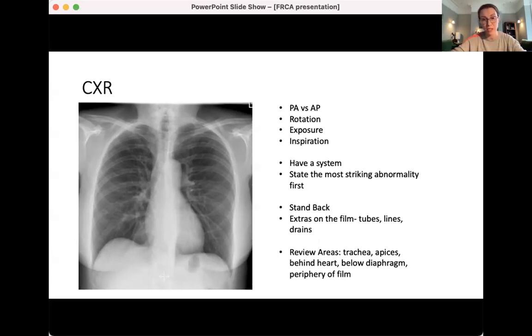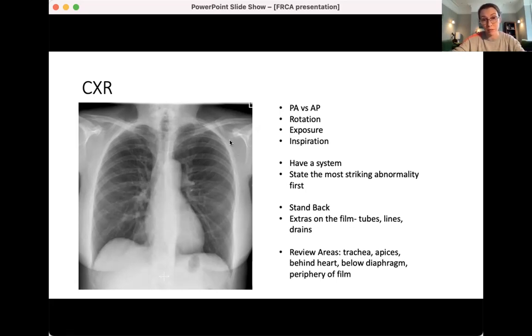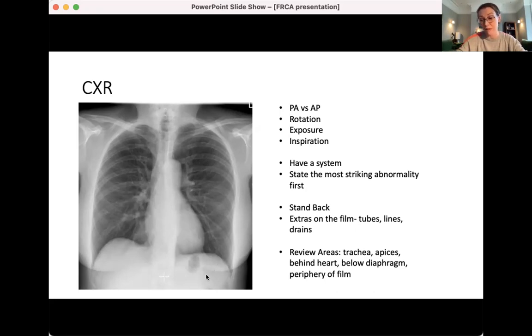Think about the extras on the film: tubes, lines, drains — anything that just jumps out at you. I look at the heart first, then the lungs around it, then the periphery. For review areas, I specifically think: trachea, apices, through the heart and mediastinum — what am I not seeing behind the heart — and then below the hemidiaphragms. Try and remember those review areas.